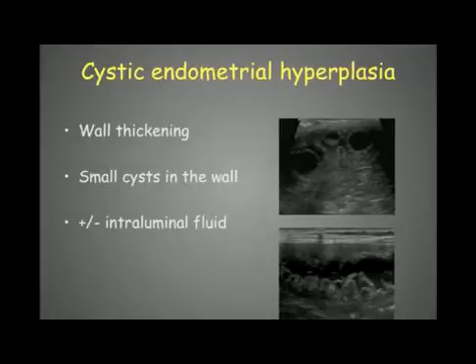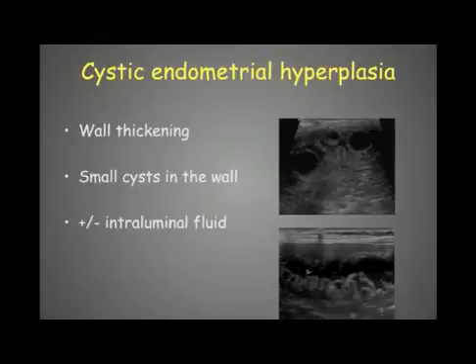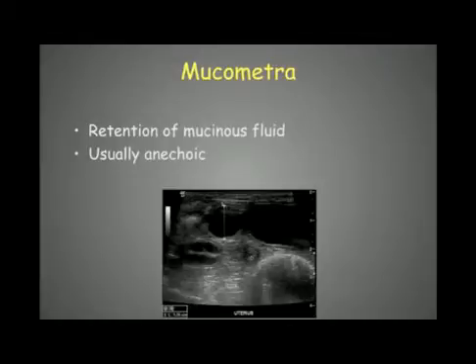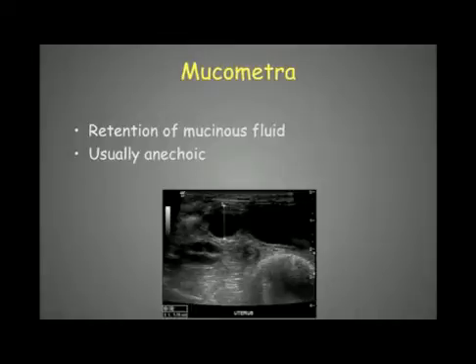Some cysts are much smaller and more difficult to see. In some cases there will be beginning production of intraluminal fluid — mucus production from glandular wall secretions. The second stage is mucomitra, with retention of this mucinous fluid. The fluid usually appears anechoic, but we must be careful: the ecogenicity of the fluid alone — anechoic versus isoechoic — can make it difficult to differentiate mucomitra from pyometra.